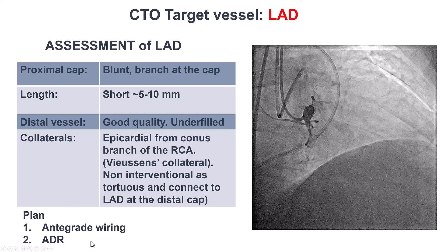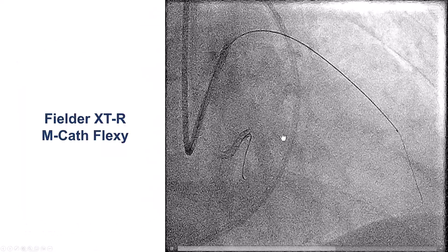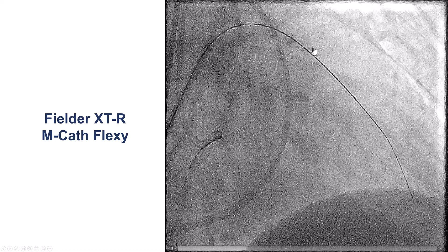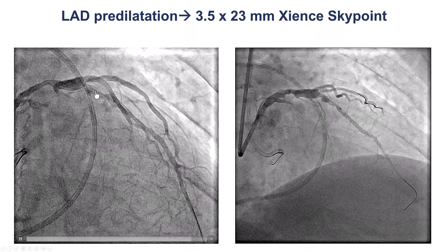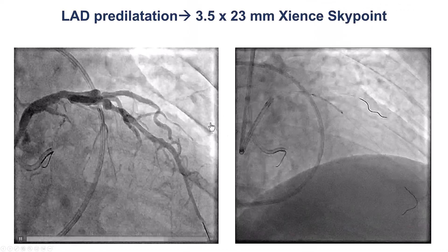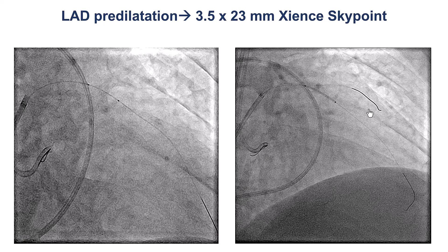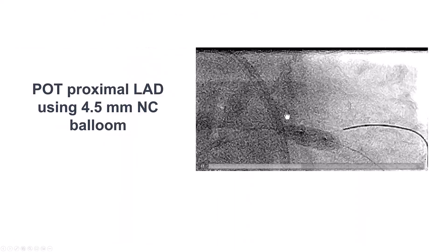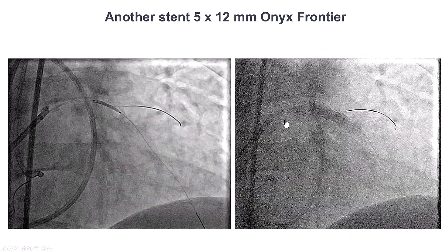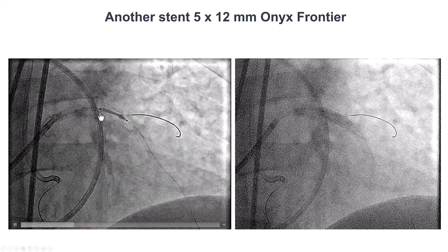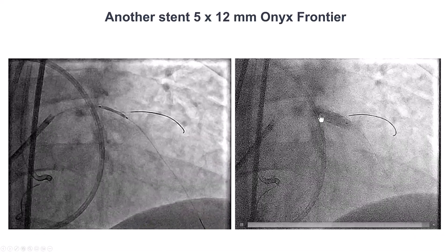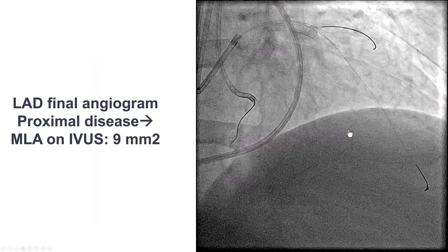If antegrade didn't work, we planned to go with antegrade dissection re-entry. As we had hoped, there was very easy crossing with a Fielder XTR and an MCAT Flexi. The microcatheter was advanced, and we were able to predilate the lesion, restoring good antegrade flow. We placed a 3.5 mm stent that was post-dilated with a 4.5 mm balloon more proximally. By IVUS, the vessel was fairly large and aneurysmal in that segment, so we ended up placing a 5 mm stent, which provided a nice result.